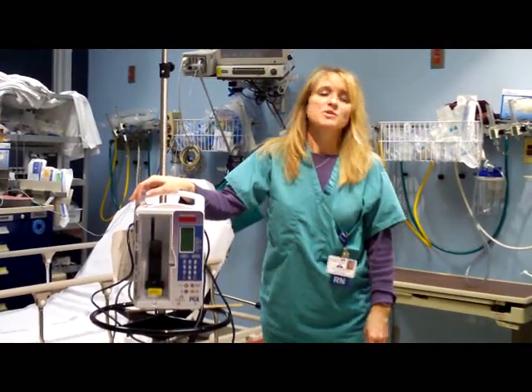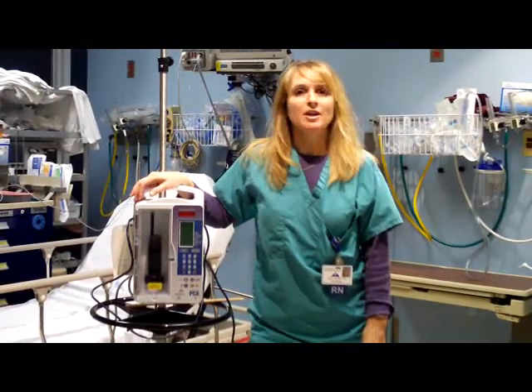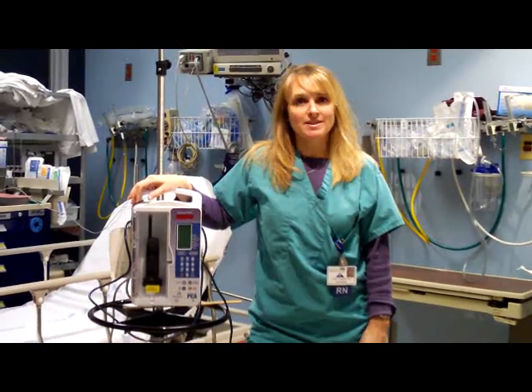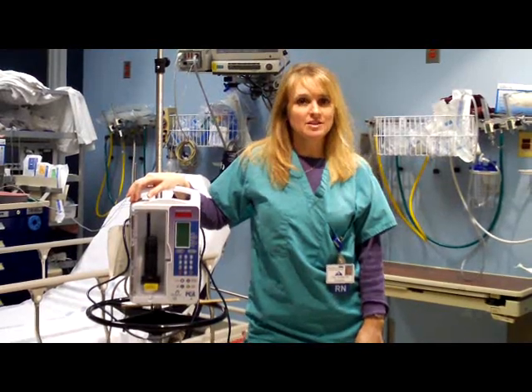IV PCA is most commonly used with postoperative patients. Common medications used in a PCA are morphine, Dilaudid, or Demerol. The PCA is usually ordered by the anesthesiologist. There are components of each PCA that need to be ordered.